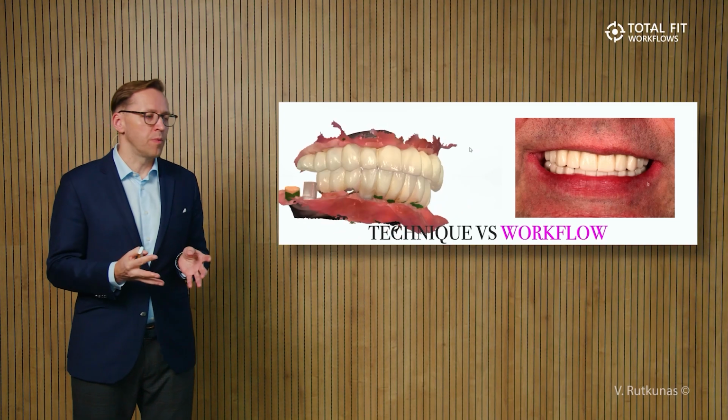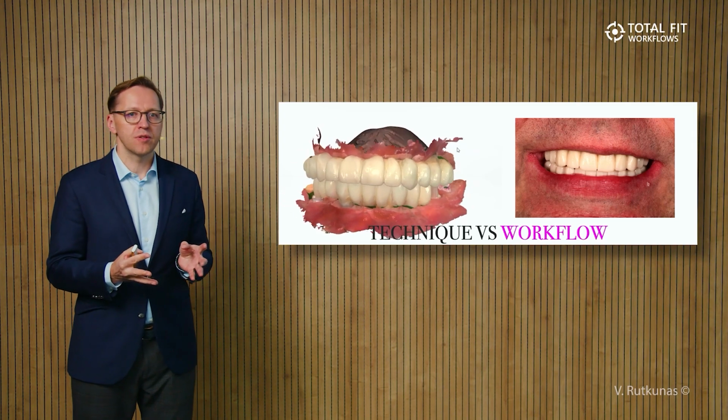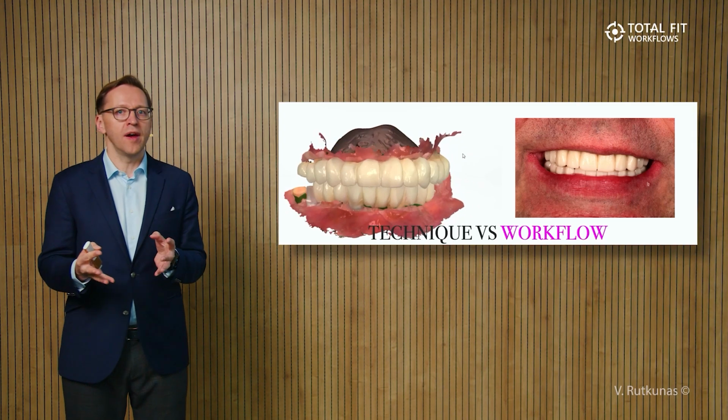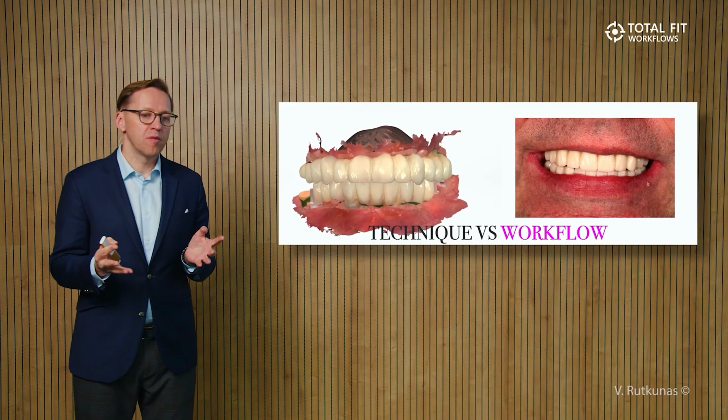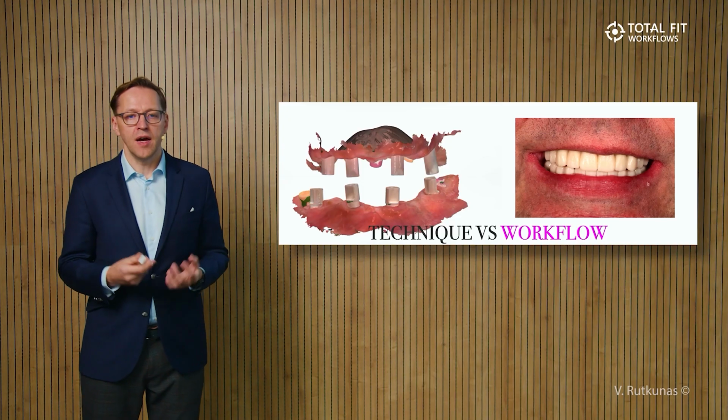If our intraoral scanner or our technique works well with capturing scan body positions, but fails with the accurate registration of the bite, then we are in big trouble. In a research paper we can have nice results, but in clinical practice we will not be satisfied with the performance.